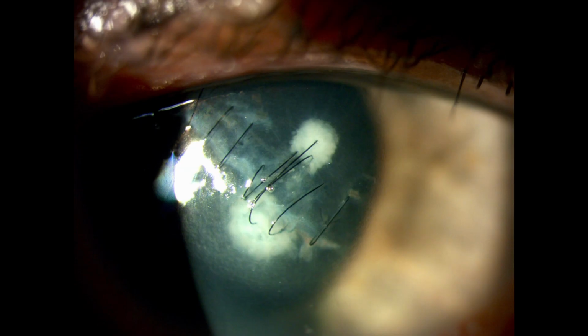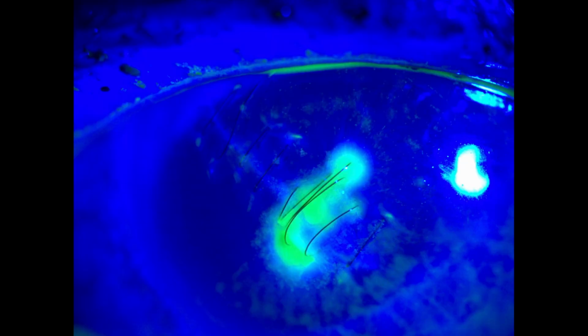Lastly, here are some loose sutures. These were loose for quite a while and kept under a contact lens, and you can see that the consequence of this is that there is now infection in the cornea where the suture goes into the stroma. These should have been removed a lot sooner than it got to this situation.